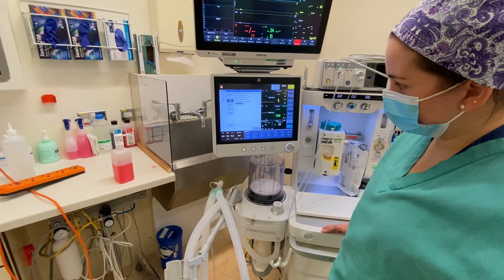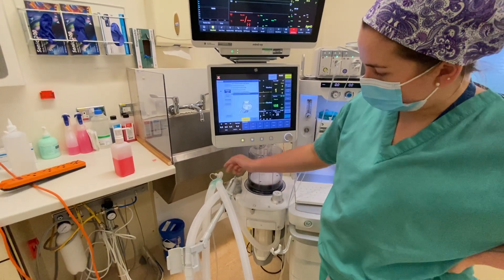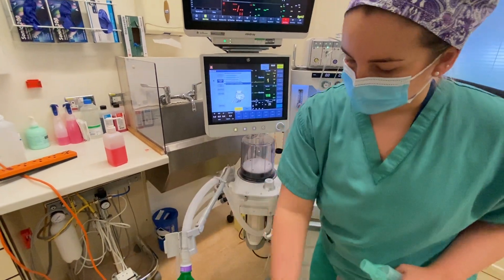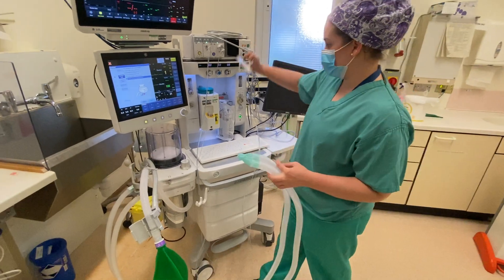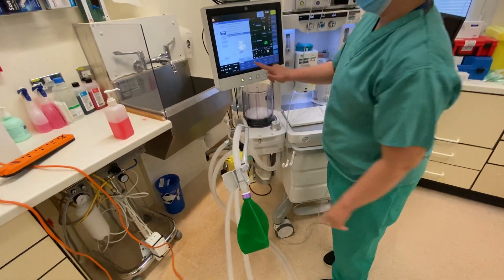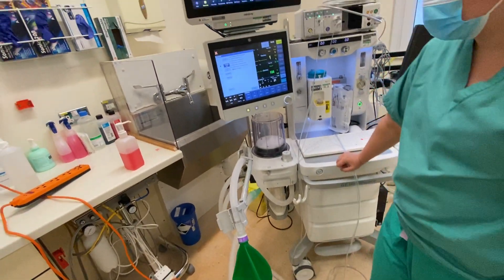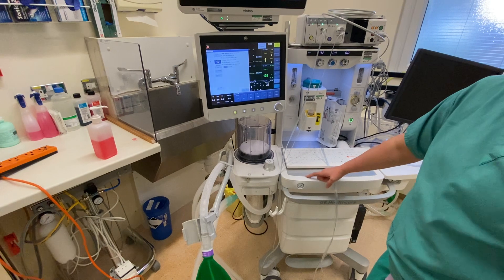At the moment it's testing for the ventilator leak, so it's asked me to open my circle circuit to make sure that it recognizes when there is a leak on our ventilator. Now it's asking me to occlude it and this further tests the leak as well to make sure the integrity of the circle circuit is all intact.